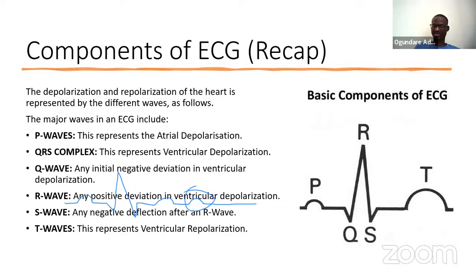I mentioned last week that it's mainly prominent in hypokalemia. There is no way to represent the atrial repolarization simply because this coincides with the ventricular depolarization. I explained that as well. I hope that is fine.